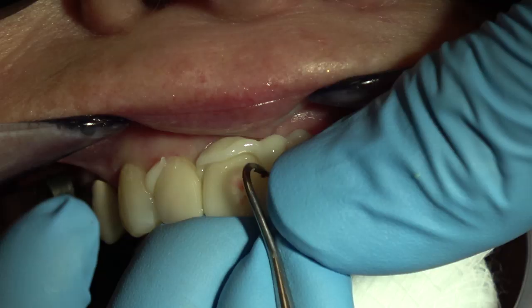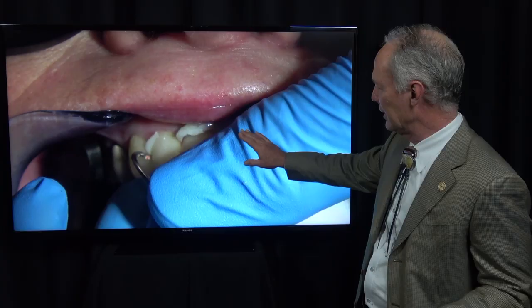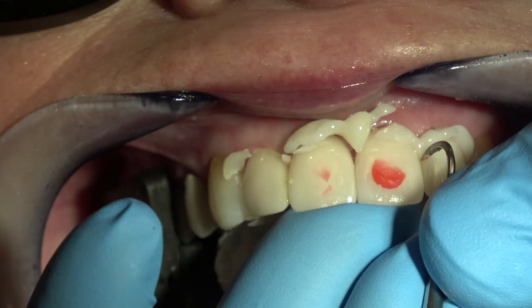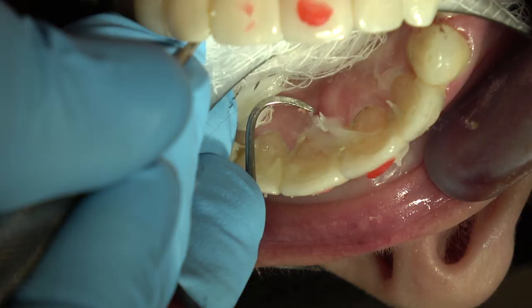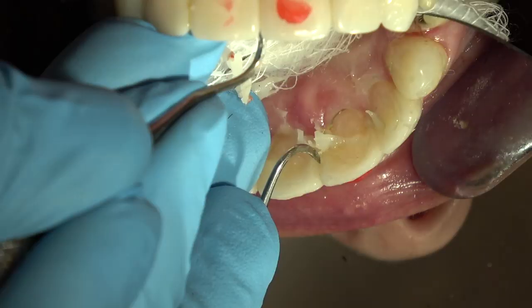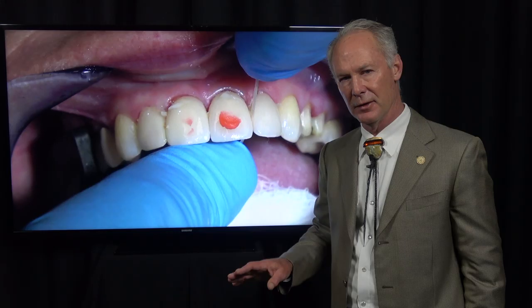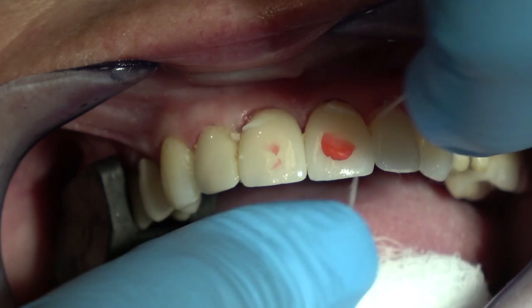If you cure it too long, it'll be too hard and you'll have to cut it off. So you want to cure it just enough that it breaks off. And I'm using the back side of a scaler and that just pops right off the teeth. You don't want it to wipe off. You want it to break off. This changes everything as far as gingival health. If you'll do it this way, a few days after you've seated these veneers, for the rest of that patient's life, the gingival tissue around these veneers will look exactly like the gingival tissue around unrestored teeth.